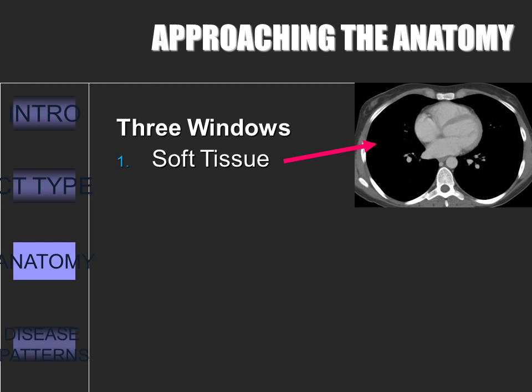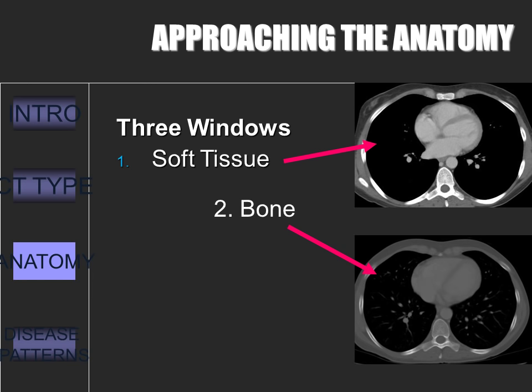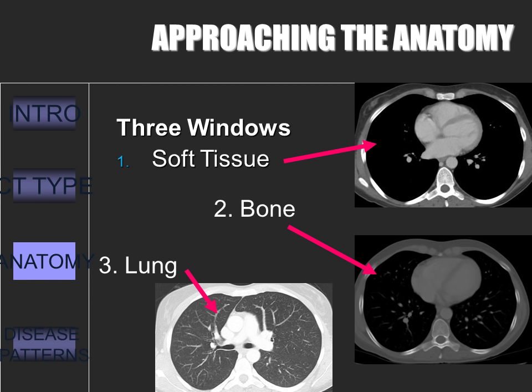Now we'll switch gears and focus on the basics of looking at a chest CT. It is important to have a systematic way of approaching the chest. There are three windows. The first highlights the soft tissues, next is the bone window, and then the lung window. I would suggest switching between windows in this order, or else you might get bogged down by the lung parenchyma and forget about the bones and soft tissues. Remember, the key is to be systematic.